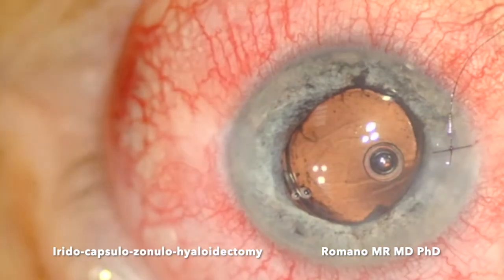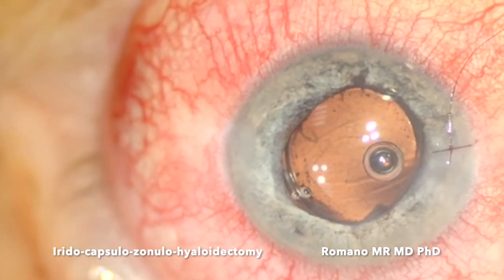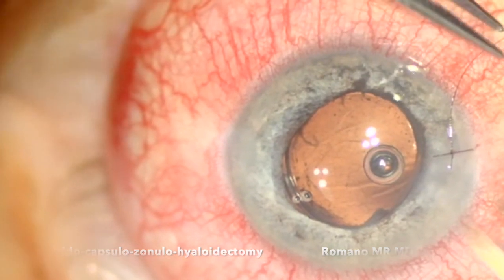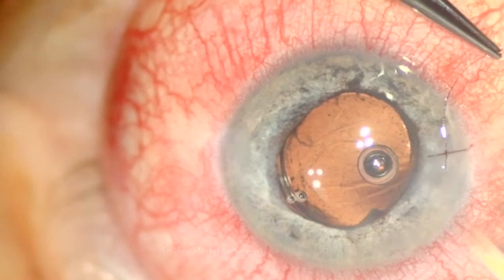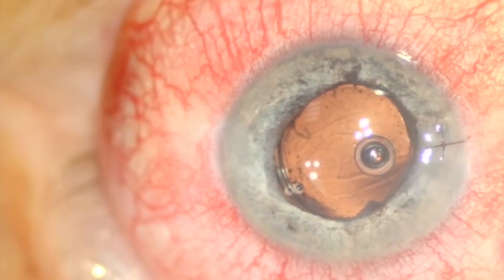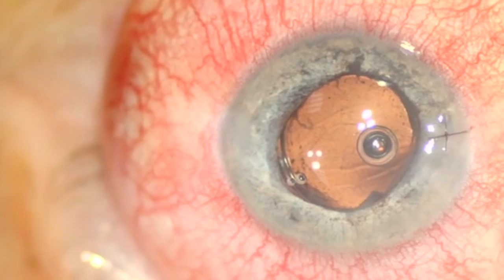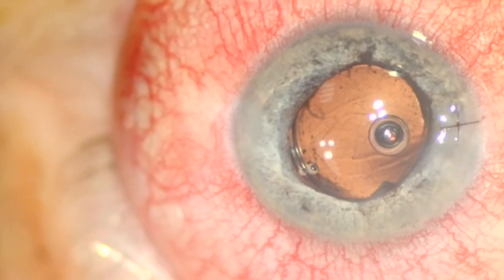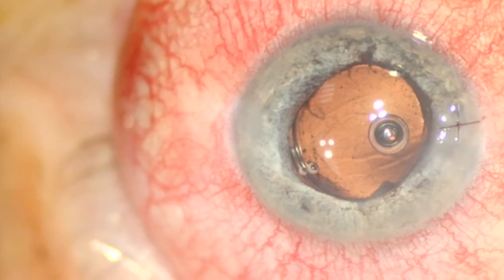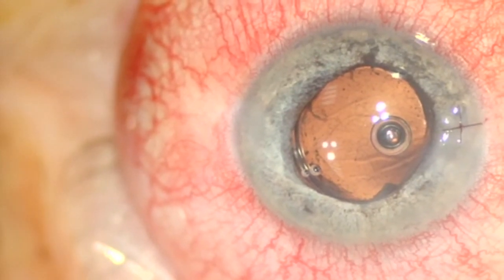By the end of the video you can see a slide with the anterior chamber at six weeks after surgery — it is deeper and the pressure went to 18 mmHg. So the surgery went very well and was very easy and fast. Thank you very much.